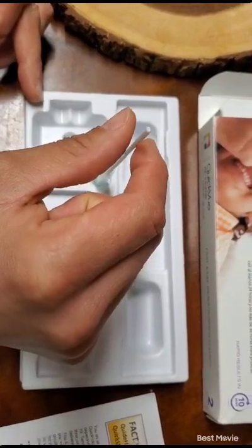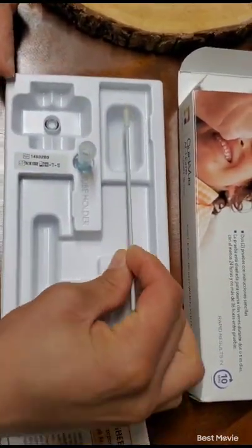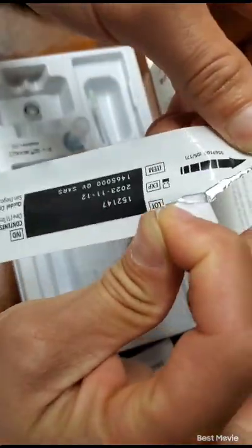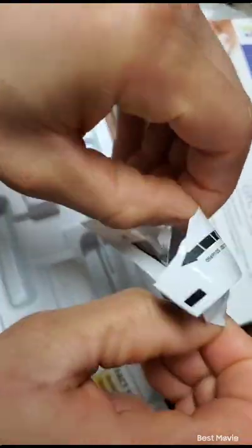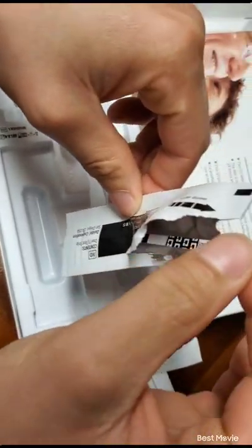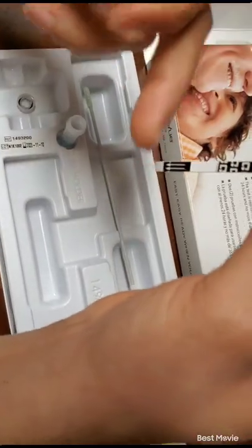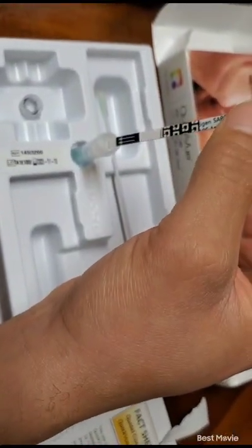Now the minute has passed — take this out. Place that right there for a quick second. We open up this; this is the testing strip, and you have to be careful. Peel it like that, you hold it like this, then you insert the testing strip with the arrows pointing down into the liquid, and you leave it there for 10 minutes.